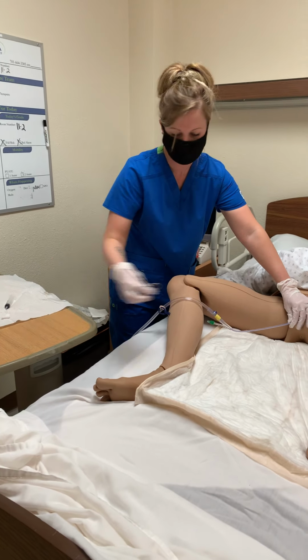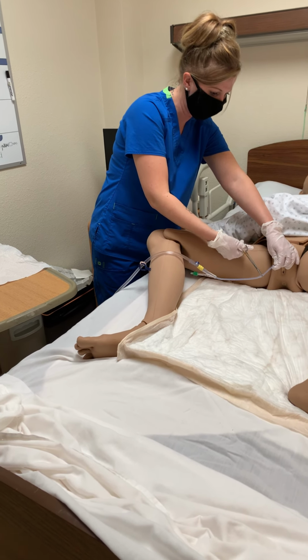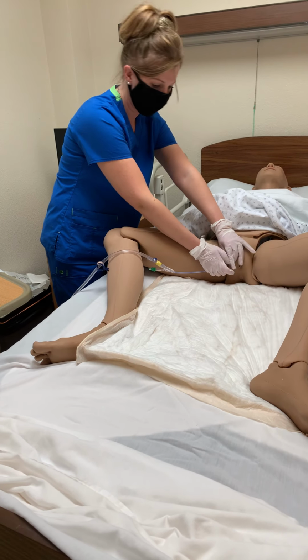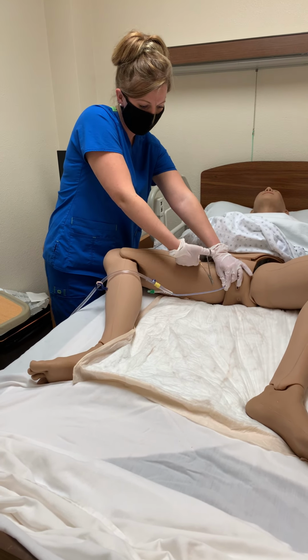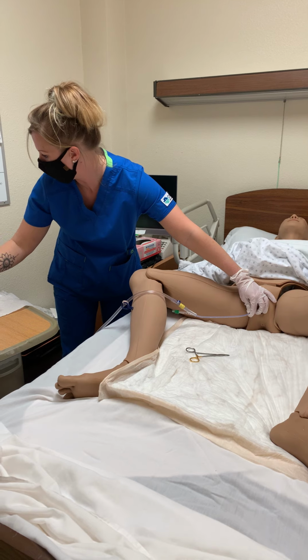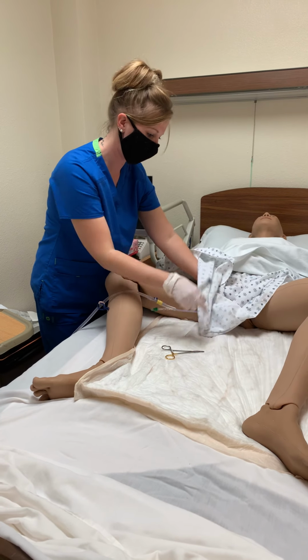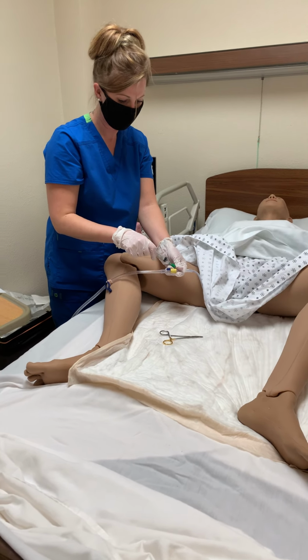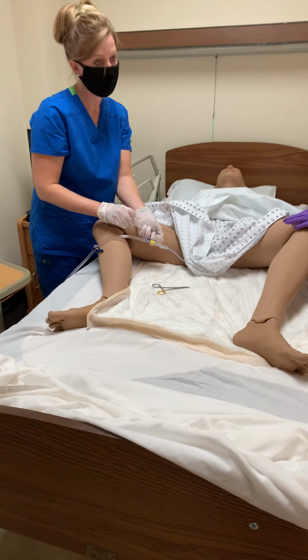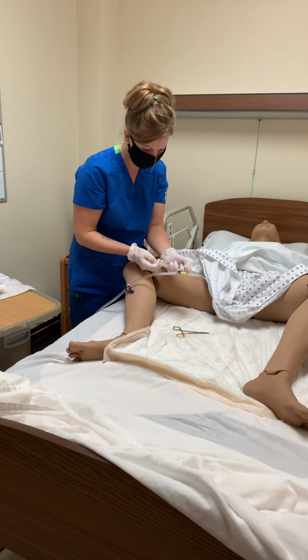So we are supposed to clamp the catheter so as not to pull it out and urine goes everywhere. Put a chuck underneath her. I'm going to ask you to take a deep breath. Whoop. I'm not going to do any of that yet because I need to take the water out, my apologies. I need to drain. I would have wiped it with an alcohol swab. I would take the 5 milliliters out. Perfect.